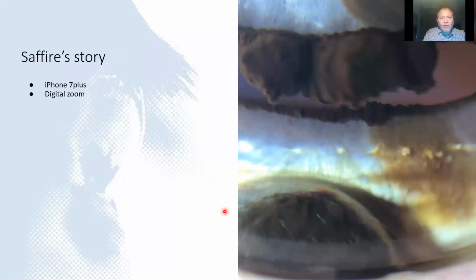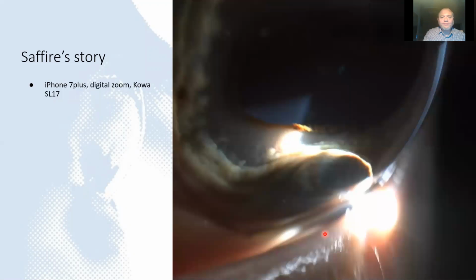So we can tell you another story showing how we can use photographs clinically. This is Sapphire. Sapphire came to us with melanomas in her eye. She's a grey horse, and this first photograph was just taken with digital zoom. So we have the light turned on, and we've just zoomed in to get the eye to fill the screen. So no macro lenses, and we can see the pupil, we can see the granular iridica, we see a lump dorsally and one ventrally.